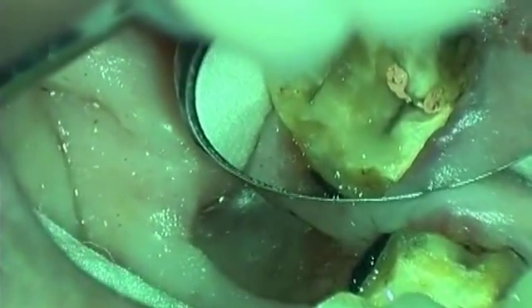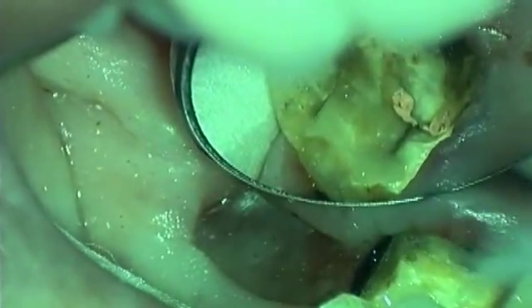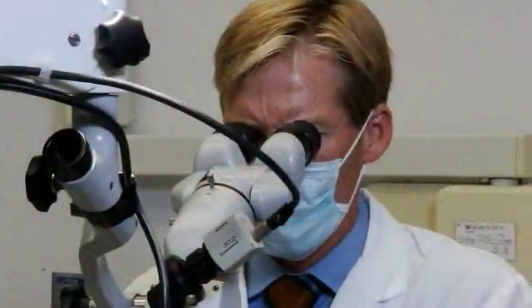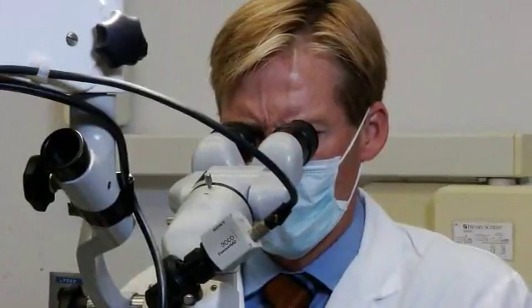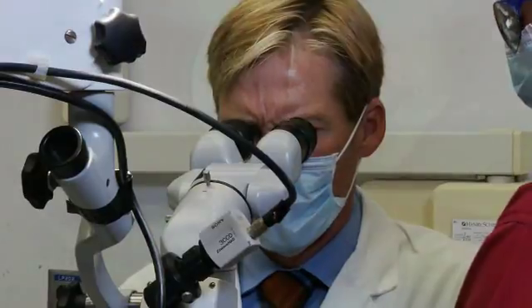While applying, keep the endo tip immersed in the cement and slowly move the endo tip upwards as the level of the paste rises. Do not remove the endo tip from the cement until the root canal has been completely filled. To minimize the entrapment of air bubbles, the immersion filling technique should not be carried out in less than 5 seconds.